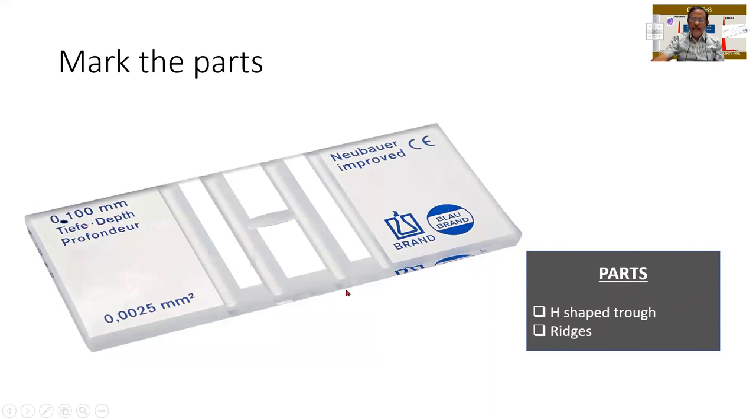And there is an H-shaped trough. Trough means there is a depression. So this is H-shaped, and there are two platforms, so I can do the counting either here or here. And also there are some raised ridges by the side. I'll show you that in a line diagram. Please remember the H-shaped trough, the two platforms for counting, and the ridges. And it is an improved Neubauer chamber.